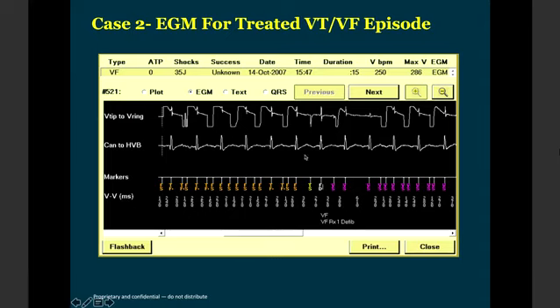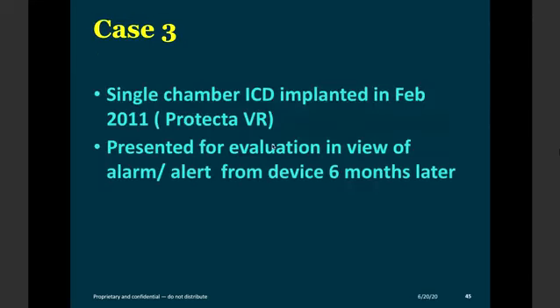This is noise. And the current devices go by the discordance between the near field and the far field, and they will abort therapy. But it will give an alert: there is a noise, go and meet your physician. He has to change your lead, but it will not deliver an unnecessary therapy for the patient. The other important advantage, as I already told you, is to differentiate between a supraventricular rhythm versus a ventricular rhythm, about which we'll come to a little later.